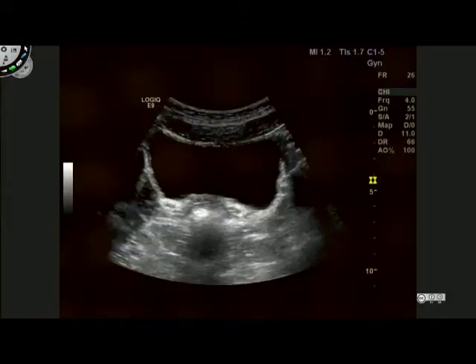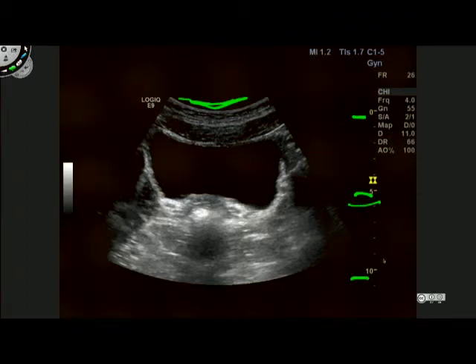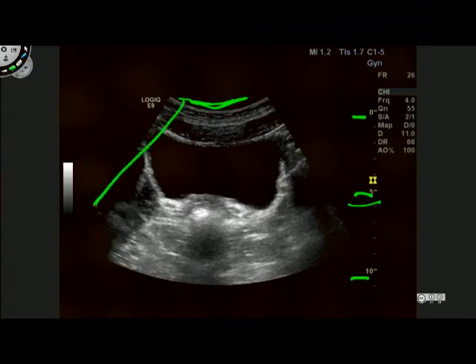Consider this example of a distended urinary bladder. What we can see on this screen is the transducer anteriorly on the pelvic wall, and along this graduation here is the depth of tissue. At this point we are 5cm below the skin surface and at this point we are 10cm below the skin surface. As the ultrasound beam fans out, it follows the shape of the transducer head.